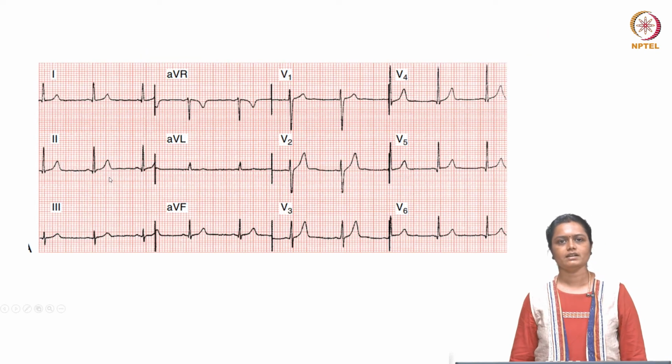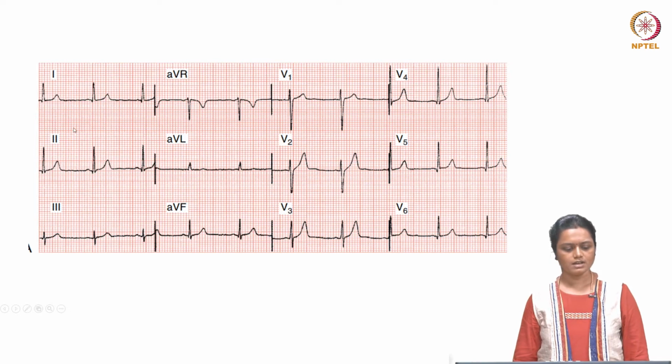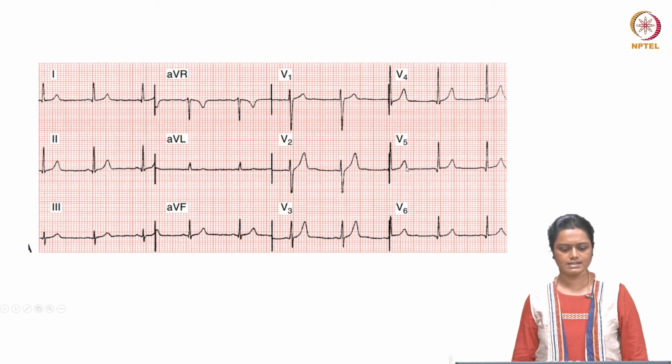This slide gives you the recording of ECG from all the lead systems. What you can appreciate from this ECG is that you will not have uniform waveforms, intervals or segments in all the lead systems. You can see here some of the waves are taller in one lead and smaller in the other lead systems. And some waves are positive in some leads and negative in other leads.